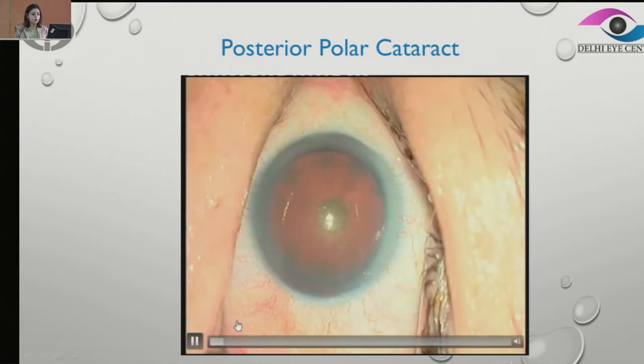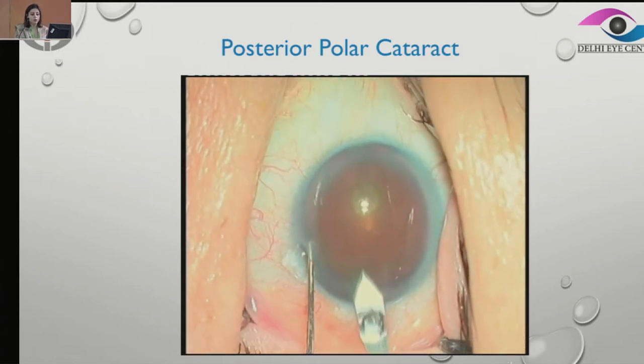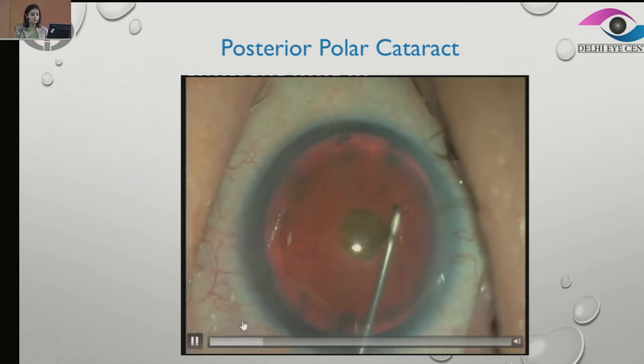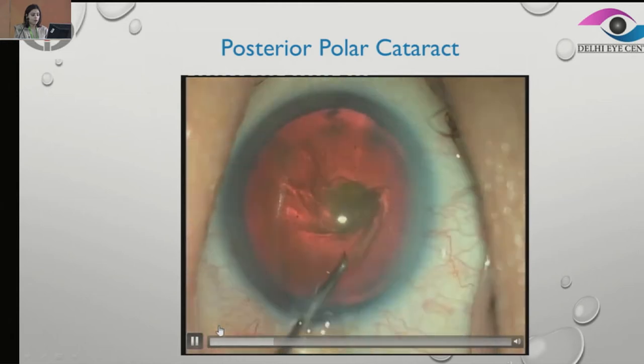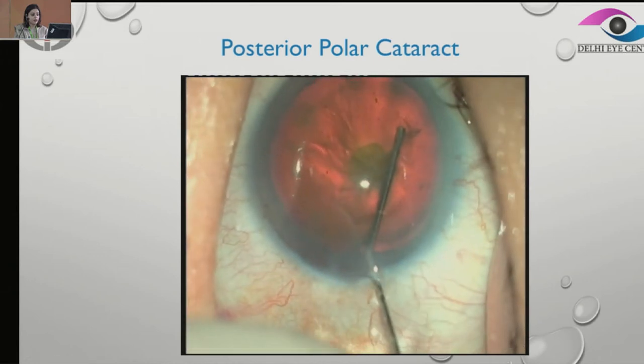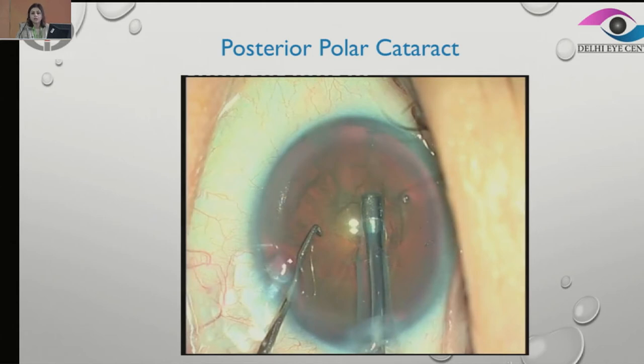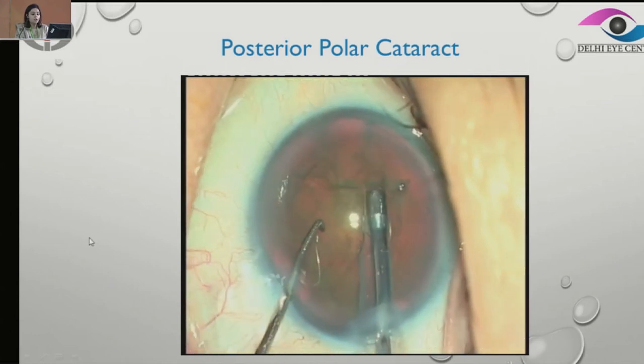This is a posterior polar cataract with significant nuclear sclerosis. We start the surgery as regular and make a decent-sized rhexis. Here, I want you to notice that we went in with a hydro cannula and were about to do a hydrodelineation, but then we realized this is a little tricky. If we do a hydrodelineation in this kind of nucleus, we might actually end up doing a hydrodissection. So we just came right back out. We have not done hydrodissection or delineation in this case.